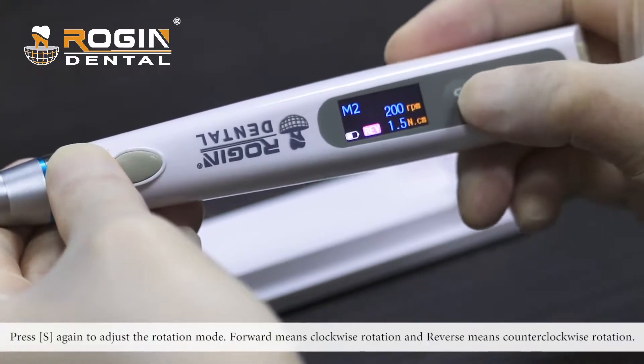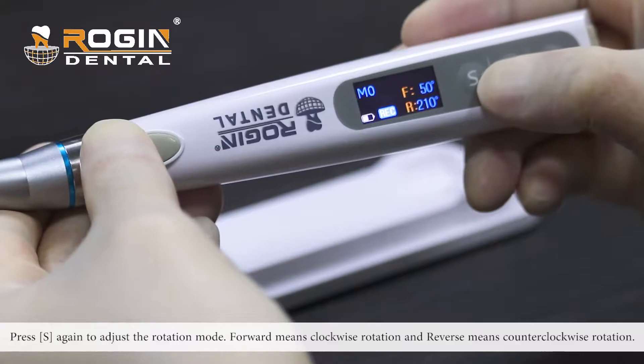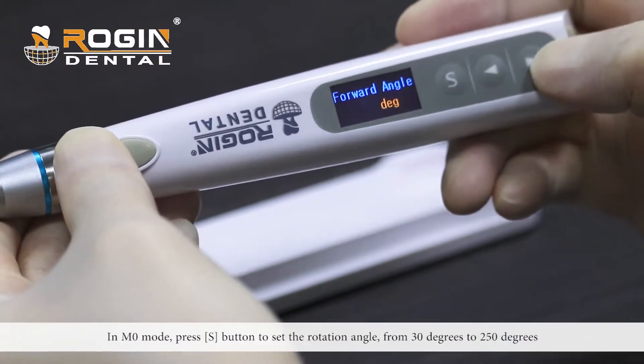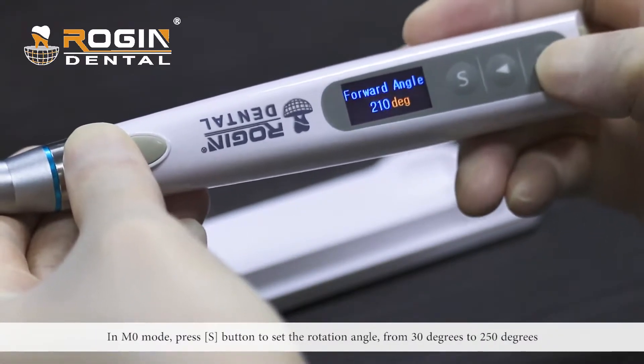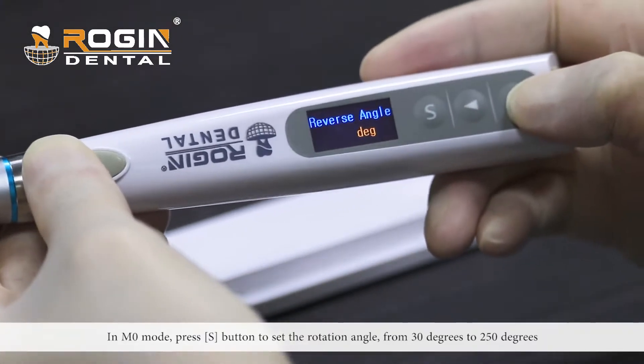Press S again to adjust the rotation mode, including forward mode and reverse mode. In M0 mode, press S to set the rotation angle from 30 degrees to 250 degrees.